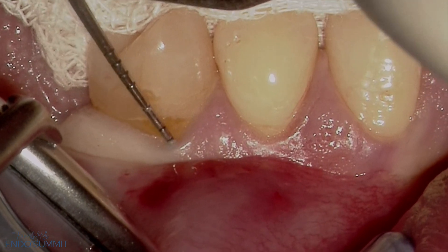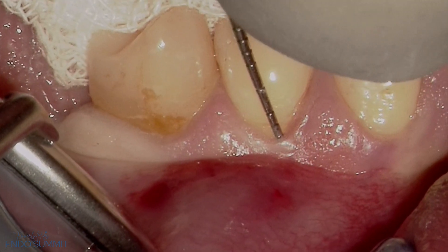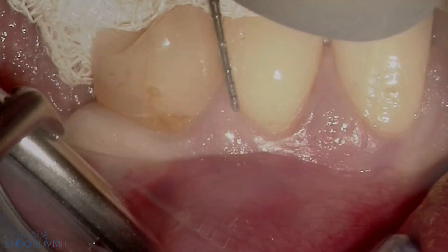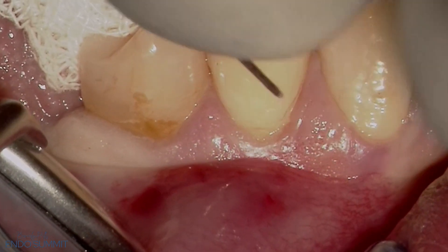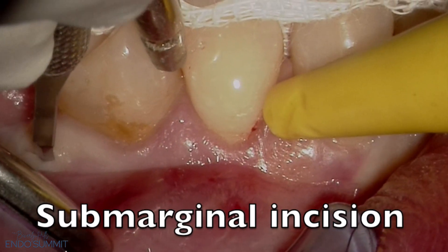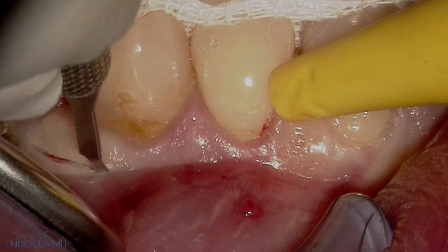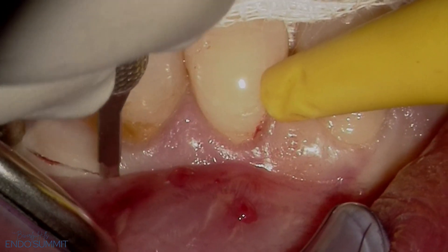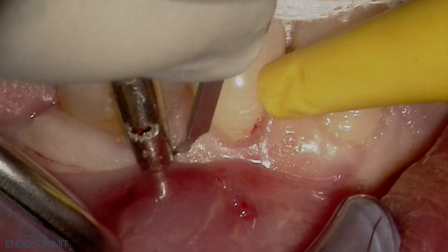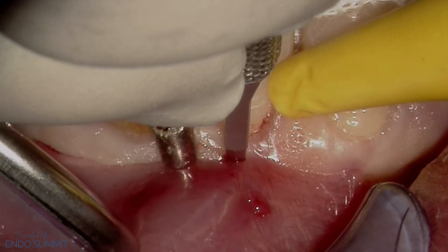You can see that this treated premolar is a tiny bit rotated. The goal here is to gain access to the cyst from the buccal, which is obviously more accessible. We're seeing that probing is being done to ensure that there's good periodontal attachment on the treated tooth and also the adjacent teeth. The procedure starts with an incision in the attached gingiva coronal to the mucogingival junction — a sub-marginal incision — to avoid recession and other periodontal compromise to the teeth. It starts from the distal line angle of the treated tooth, progressing from distal to mesial, which is a very important surgical principle.